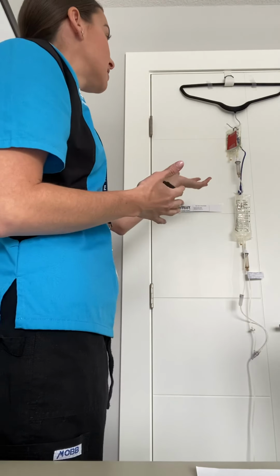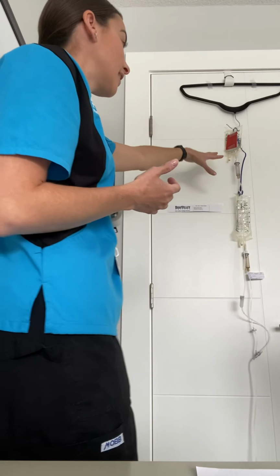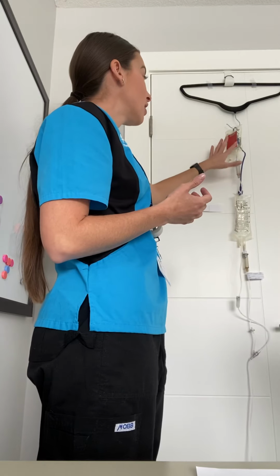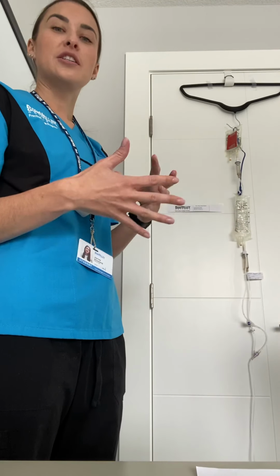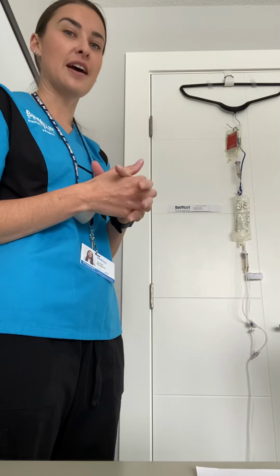And then with the IV itself, we do want to make sure the IV piggyback here is higher than the solution here, the secondary or the primary line. And then we also want to make sure that we have drips coming out, that there's no kinks here. So if you can kind of keep your arm in a reasonable place that works for you and keep it with no kinks and things like that, that would be great.